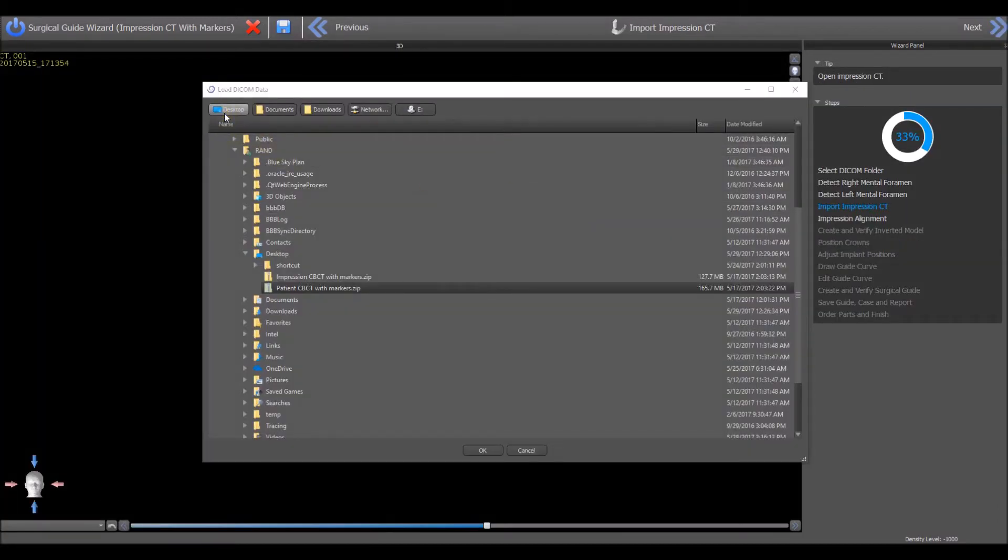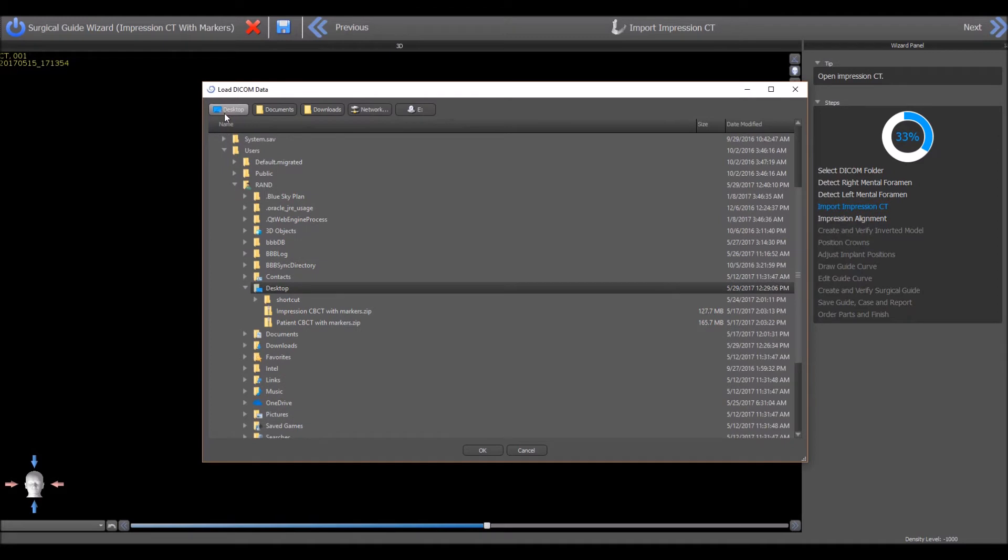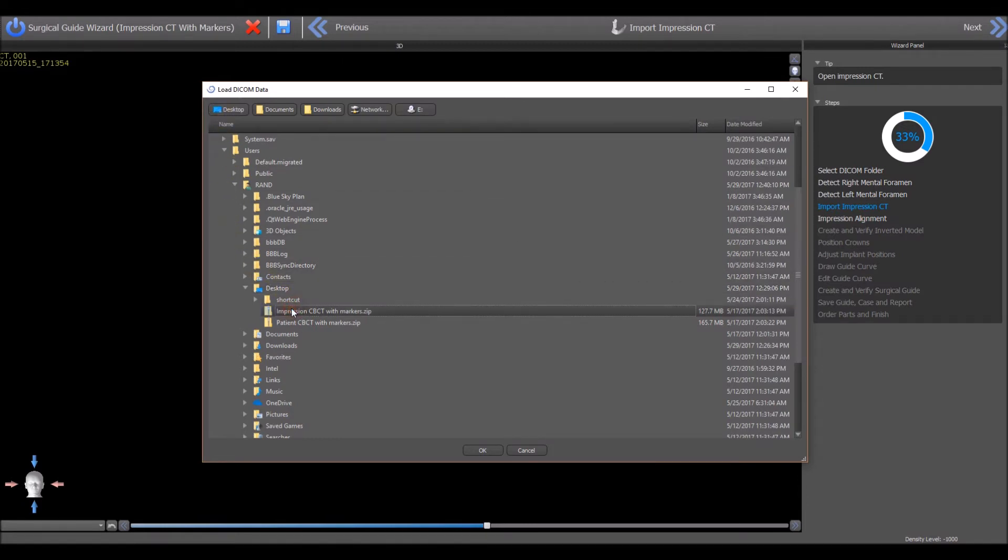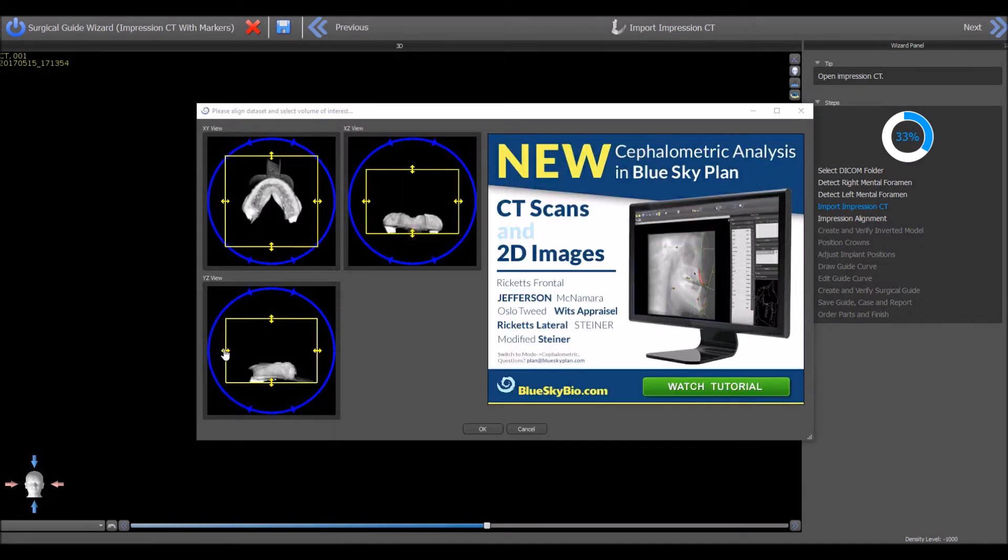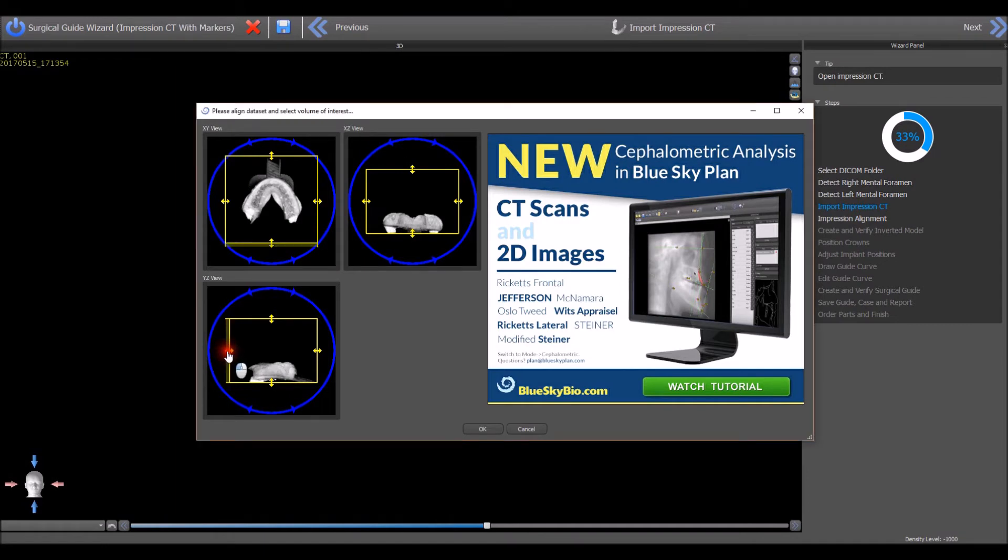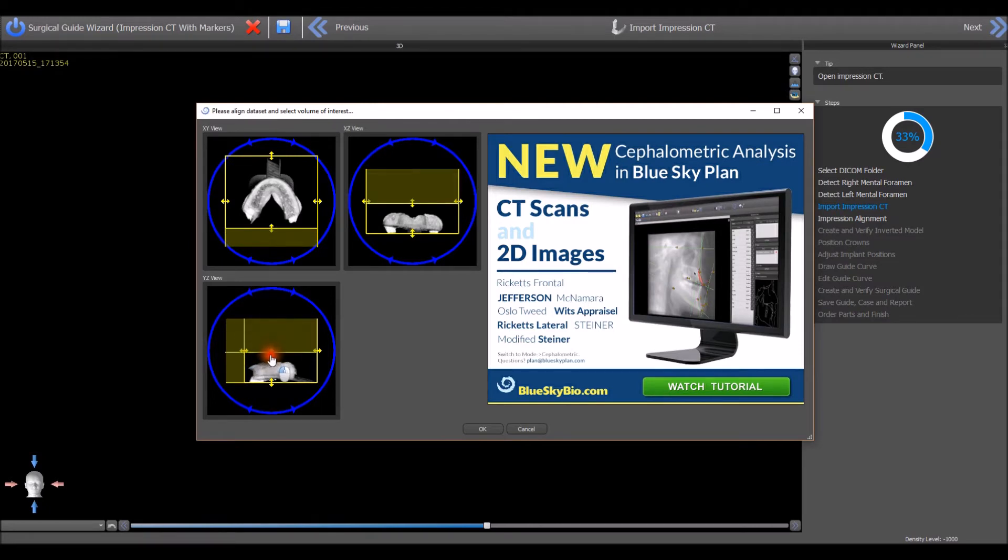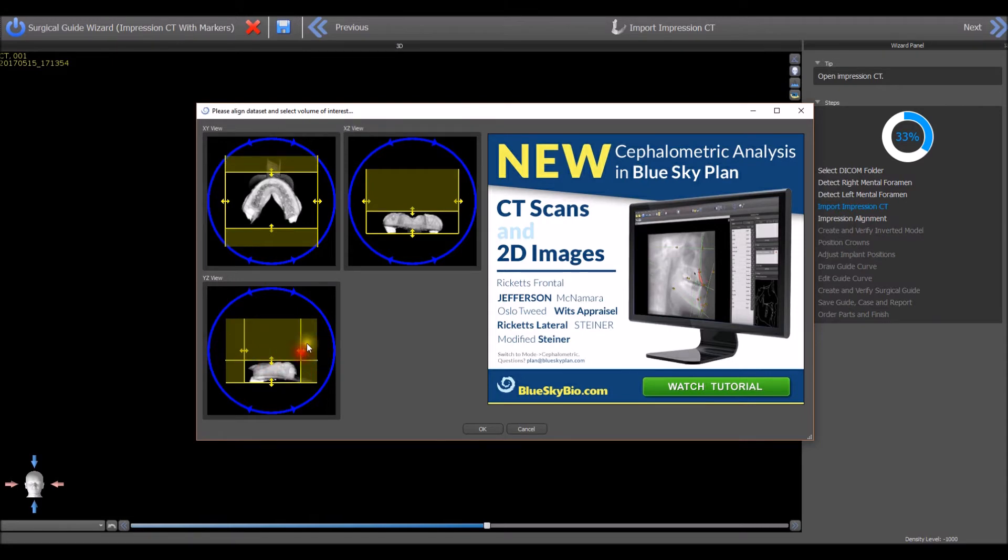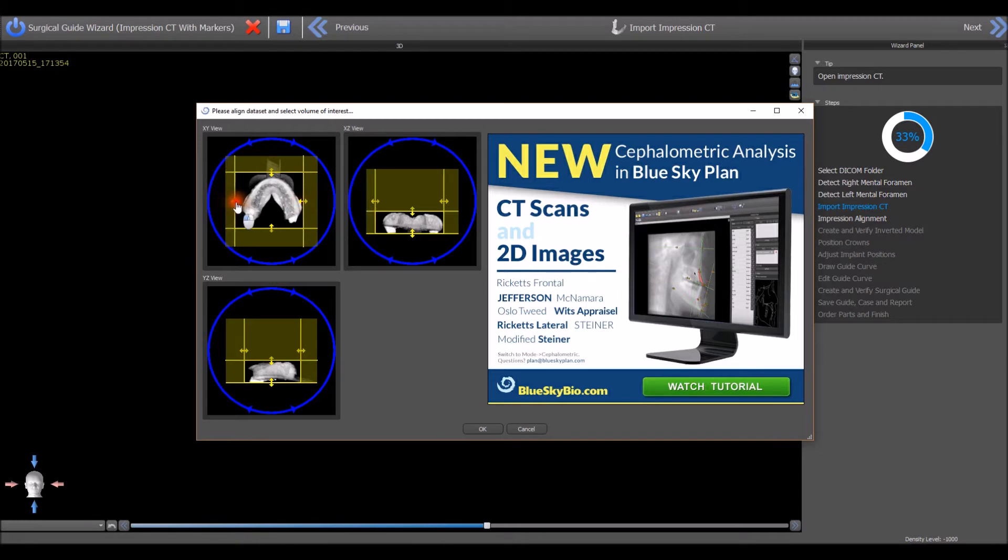Press the Desktop button in the top horizontal toolbar to navigate to the desktop of your computer and choose the file ImpressionCBCTWithMarkers.zip. Press the OK button. Left-click to grab and drag the yellow border lines to reduce the field of view and define only the area of the scanned impression. Press the OK button.